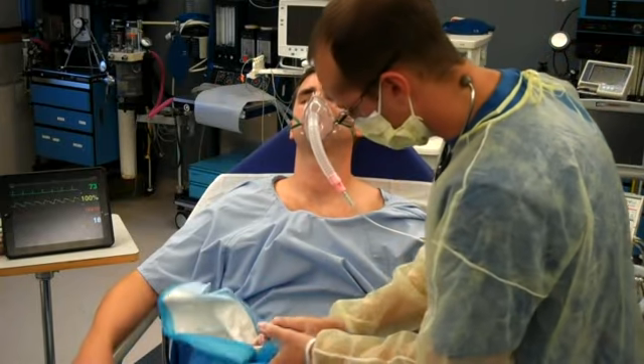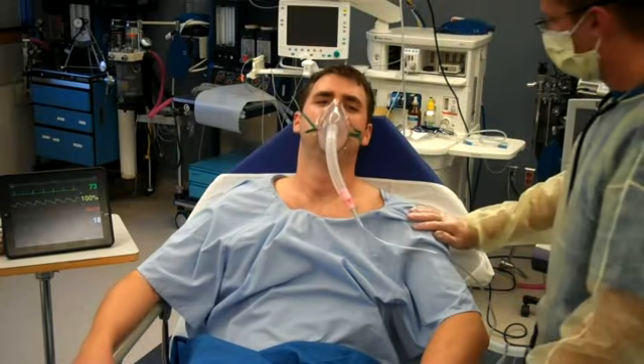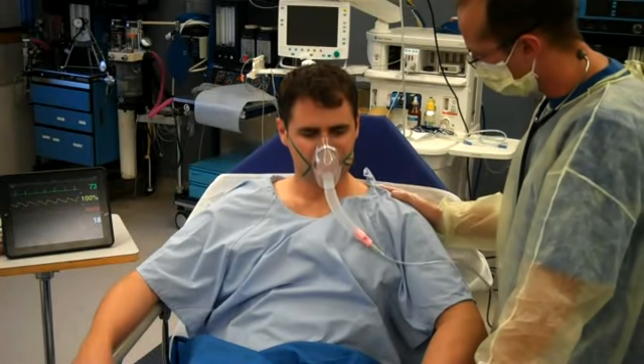Don't want to make any mess at all. Is that feeling a lot better? That's good. Nice to be able to talk, eh? [Patient]: Yeah. So what I'm going to do is talk to the team and tell them we took that tube out and everything went well.